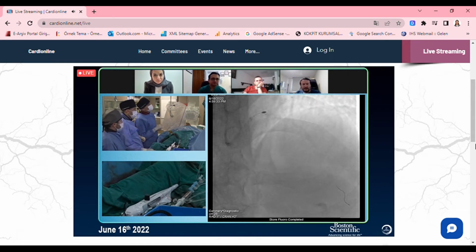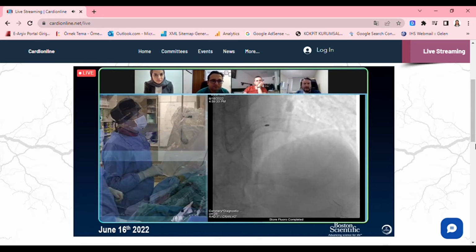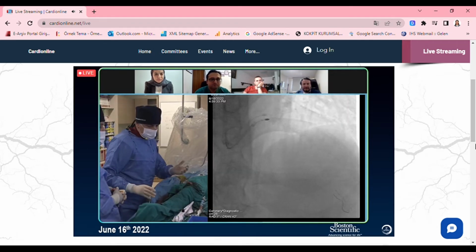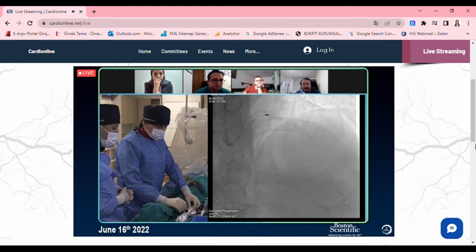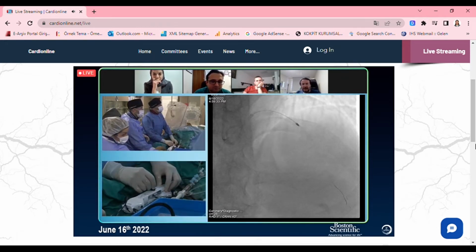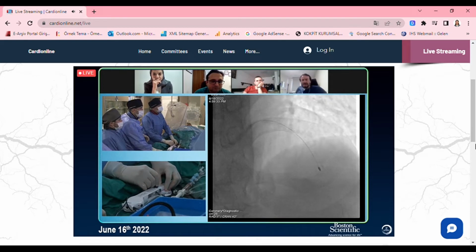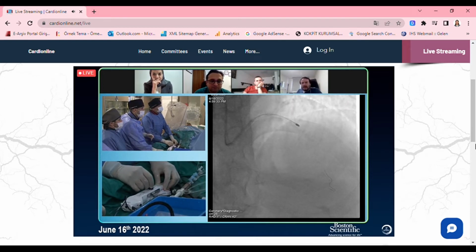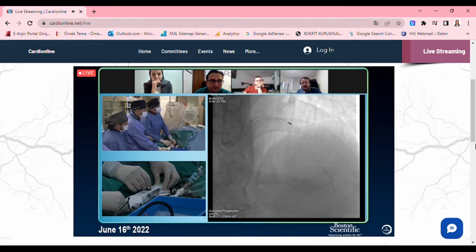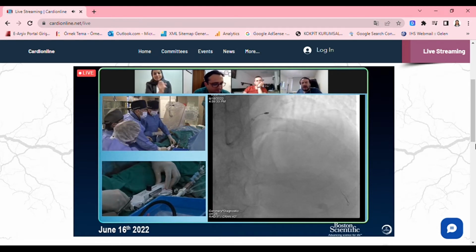I think we did our rotablation. Let's do another position, and then we finish it. Are you going to do another IVUS? I will do IVUS again, but after dilatation with the balloon. So it would be very interesting to see what the Rota did to the eccentric calcification there. It would be very educational.